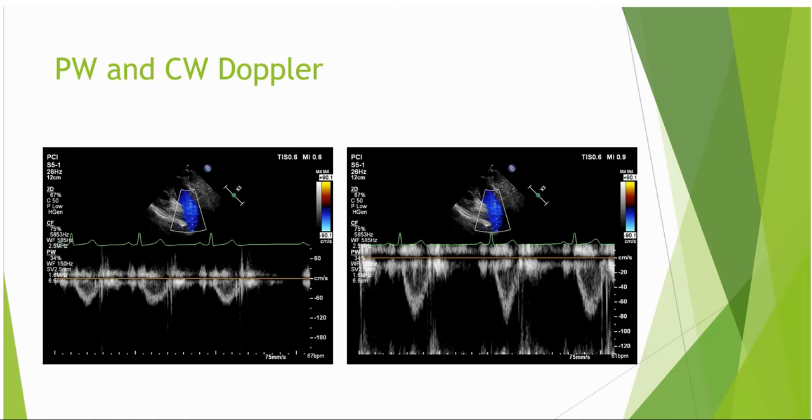Another way to look at this is that maximising the flow profile with scale adjustment is like applying a zoom box in 2D imaging. The flow profile will appear larger in the spectral trace and become more readily identifiable. When we measure in 2D, it's preferred to do so during a zoom. So the same principle really applies to a Doppler box as well. We will be able to be more accurate with our caliper position and error is less likely to be significant.